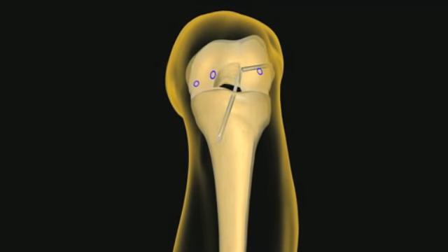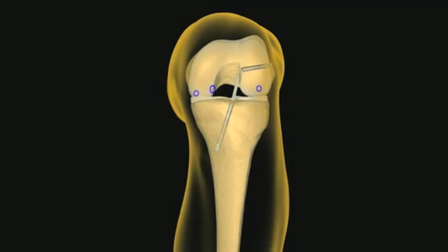Additionally, with this technique, a notchplasty is generally not needed except if an unnatural anatomy, such as an A-shaped intercondylar notch, is present. These are a few of the numerous advantages of using the ConMed Linvatec Bullseye Anatomic Cruciate Reconstruction System and the Anatomic Single Bundle Technique.